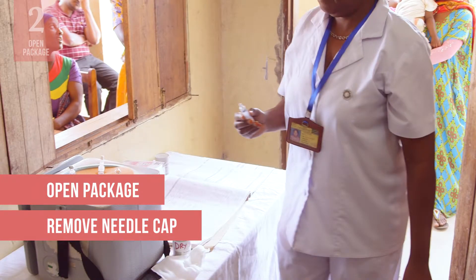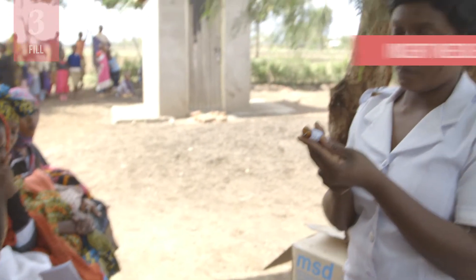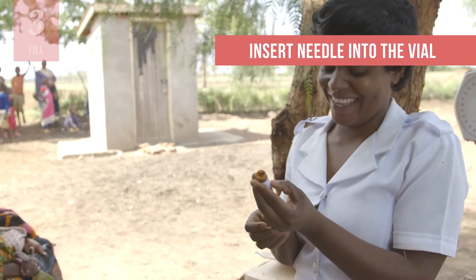If the needle does touch any non-sterile surface at this point or at any point before injection, discard the needle. Insert the needle in the vaccine vial or ampoule.